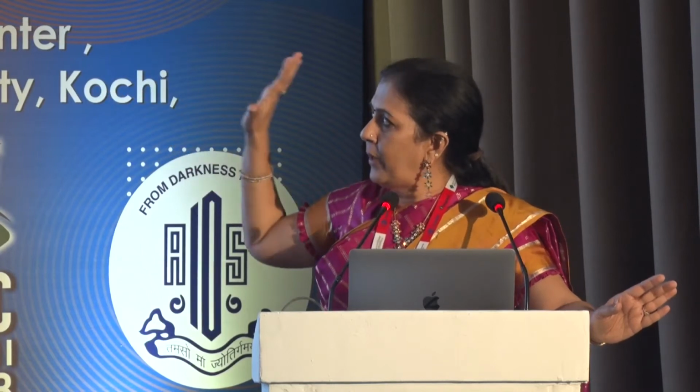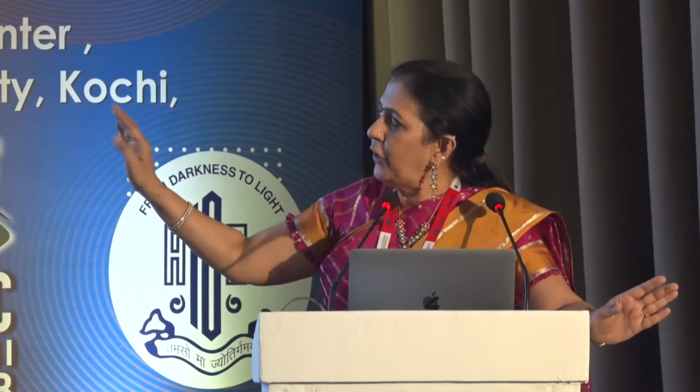I go about my chops. Things are going well. But look quite carefully. I have completed my chop. Look at that small area superiorly, that area of zonular weakness. I go back and place another capsular hook. Because the vitreous has not come forward, I'm going to push back the vitreous, keep my phaco probe right in the center. But then again, there's a lot of nucleus matter, and I'm not too sure.